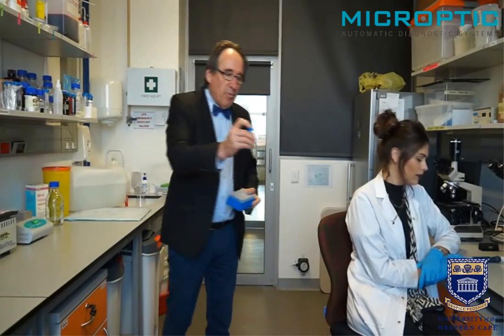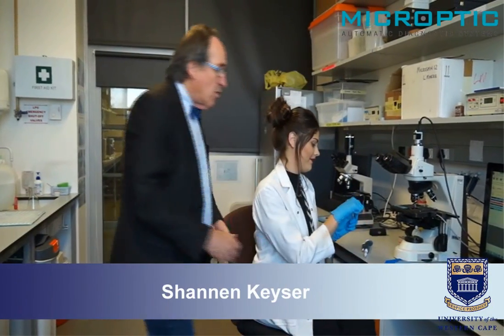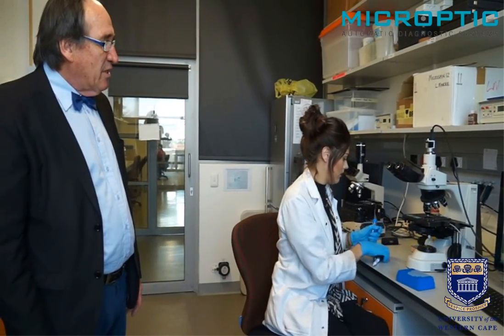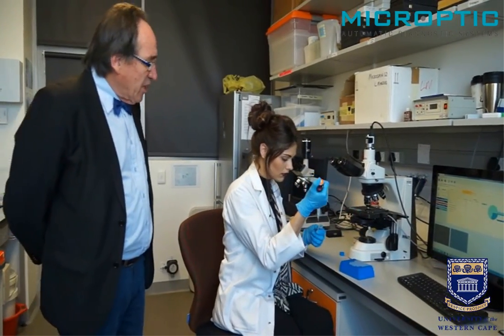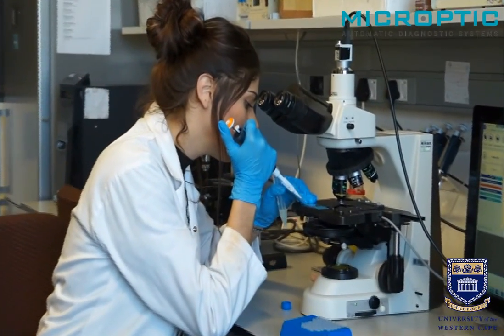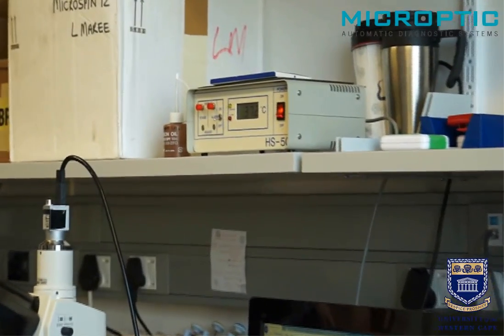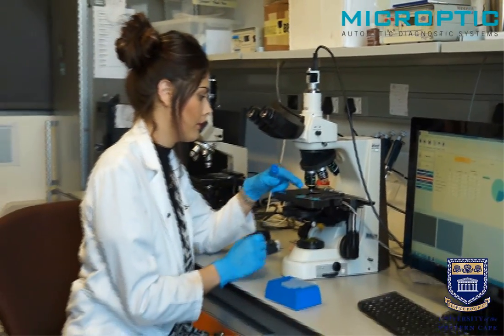I am now going to hand the sample over to MSc student Shannon Kayser. It is pre-warmed, as well as the tips. She will set the microscope to the ideal optical conditions for measuring sperm motility under positive phase contrast, then inject approximately 2 to 3 microliters of the pre-warmed semen into the Leia chamber, which has also been heated to 37 degrees centigrade. We leave the slide for about 30 seconds, just for the sperm to settle.